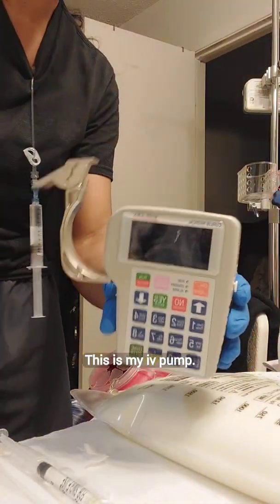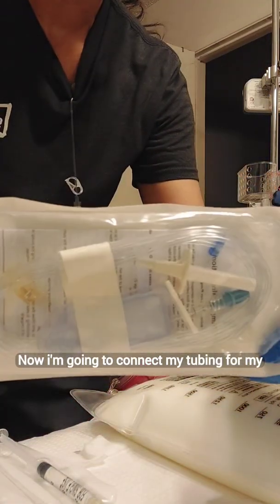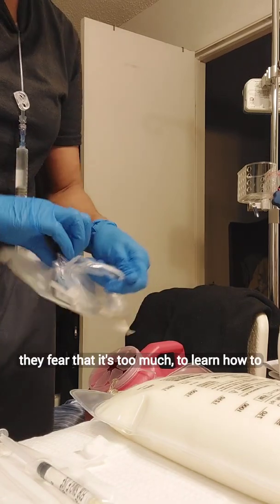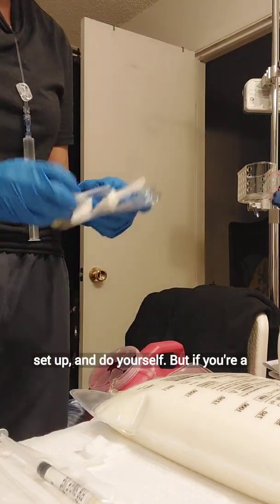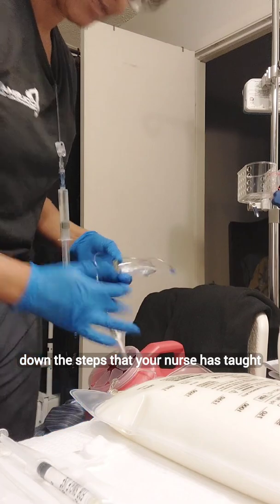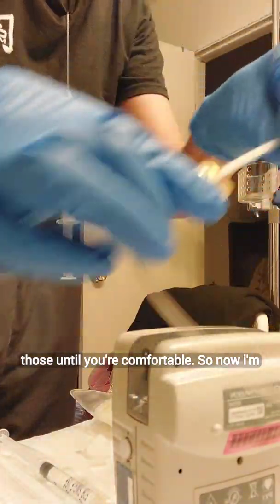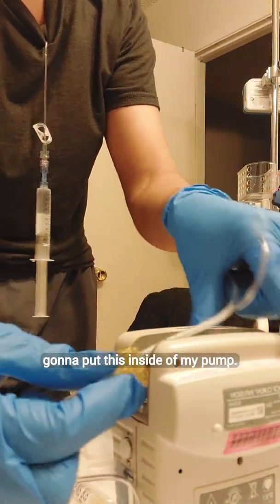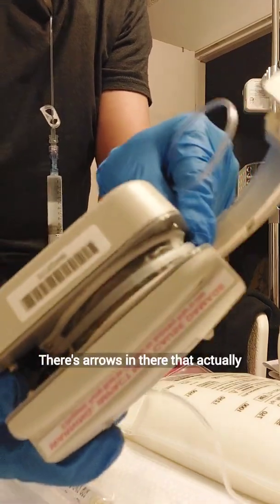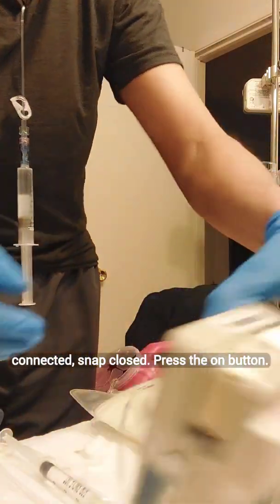This is my IV pump. Now I'm going to connect my tubing for my TPN. A lot of people fear being on TPN because they fear it's too much to learn how to set up yourself. But what you can do is write down the steps your nurse has taught you, then follow those until you're comfortable. I'm going to put this inside of my pump — there are arrows in there that tell you where it goes. Once it's connected, snap it closed.